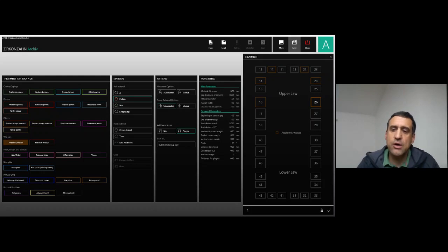We were speaking also about the different scan bodies we have available. And I select, just to implement and finish my project, that you have the gingiva. Of course, when you have implants, we need to select gingiva because our emergence profile is detected on the surface of the gingiva. So 6 implants with scan body and with the gingiva selection.